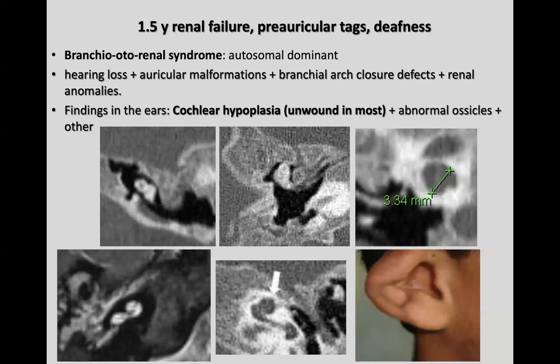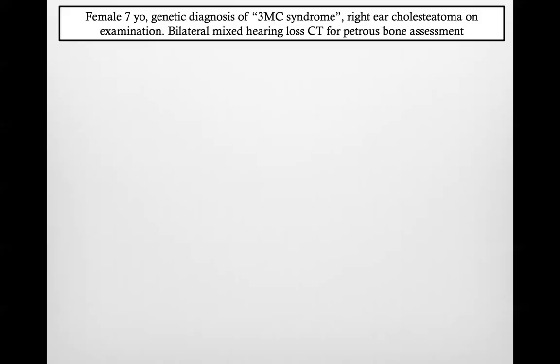Again, in the same Neuroimaging Clinics of North America issue where there is the paper from Kelly Robson, we wrote with Kelly Robson a paper on syndromic causes of hearing loss that summarizes all these complex associations that can be helpful in your clinical practice. Look at this other case. I will keep it practical and case-based.